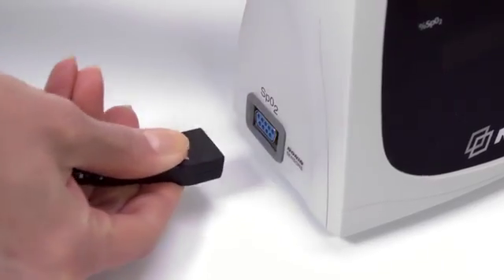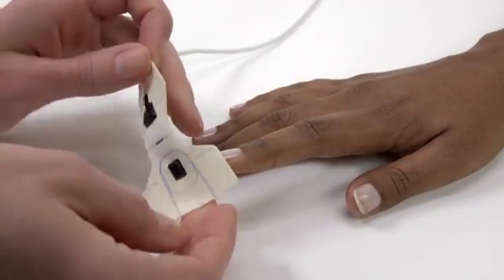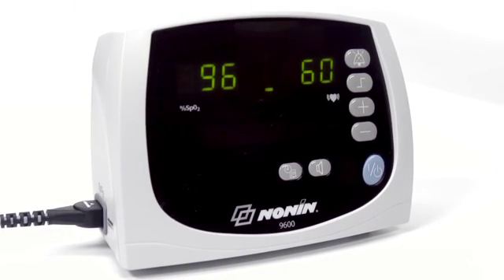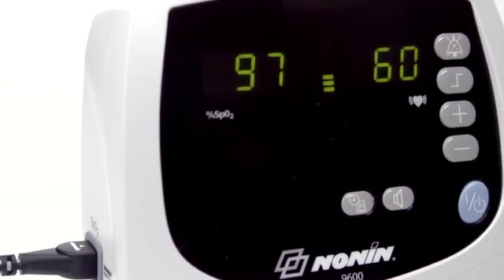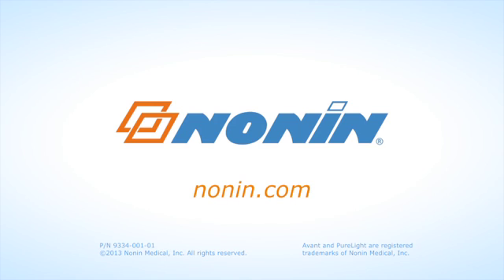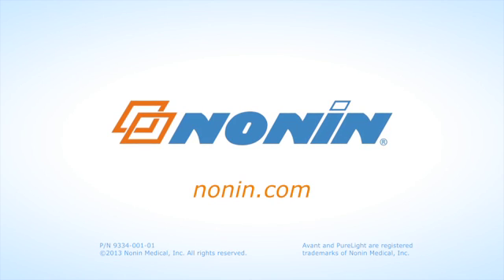Then remove the sensor and unplug it from the oximeter. With proper use, the Nonin Avant 9600 pulse oximeter will provide consistent, accurate oxygen and pulse rate measurement. You can find additional use information on this and other Nonin products at www.nonin.com.